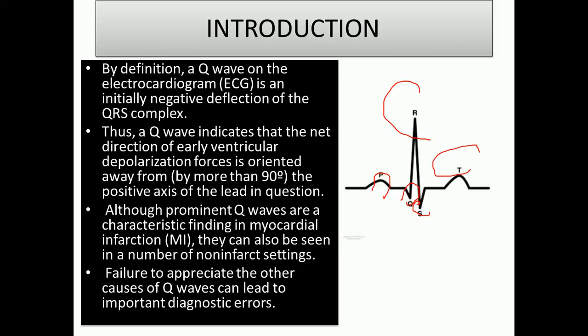Although prominent Q waves are a characteristic finding in myocardial infarction, they can also be seen in a number of non-infarct settings. Failure to appreciate the other causes of Q waves can lead to important diagnostic errors.